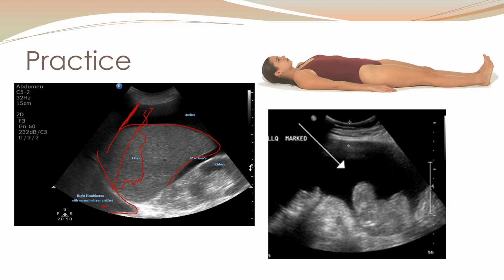So this particular image was probably obtained in this region, where they're seeing the pleural space here, the liver here, and that kidney and lung here. And that's a great access point to check for right pleural effusions and to look for any free fluid in Morrison's pouch or other ascites. Now here we're in the left lower quadrant in transverse, and you can see that there's ascites here with bowel contents floating around. And so this image was likely obtained transverse right at this level.